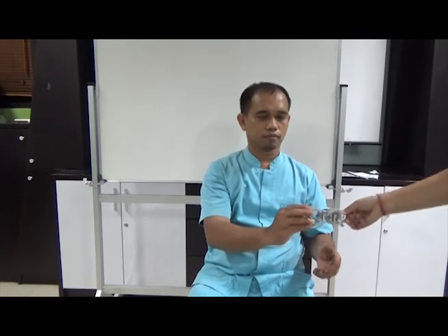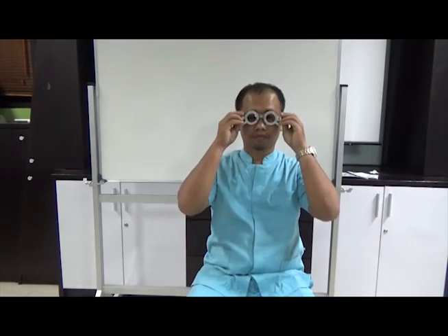In this video, we will show you how to measure near distance visual acuity with a Jaeger chart. We will be using the 4-Opta trial frame, which is where we will mount the lenses. Before we start — do you usually wear glasses? No. How old are you? 50. Since the patient does not wear habitual glasses, we will start with recommended lenses according to their age group, which is plus 1.50 for the age group of 50 to 54.